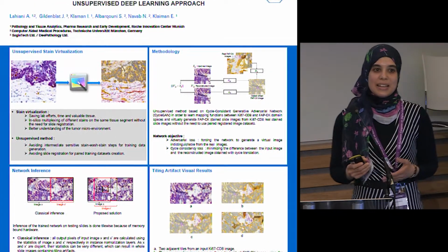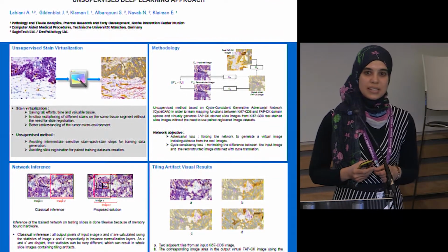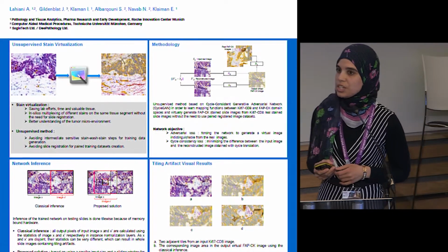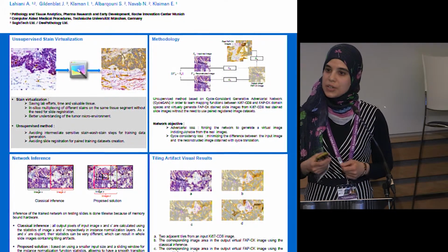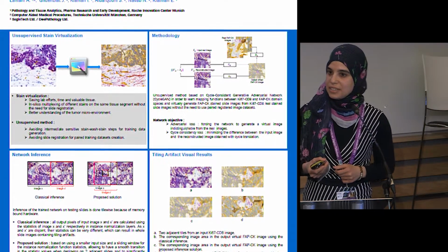And this would allow us to multiplex different stains on the same tissue and with the same coordinate system without having to deal with slide registration. And the use of an unsupervised method allowed us to avoid the need to generate and to deal with registration in order to create our training data set.